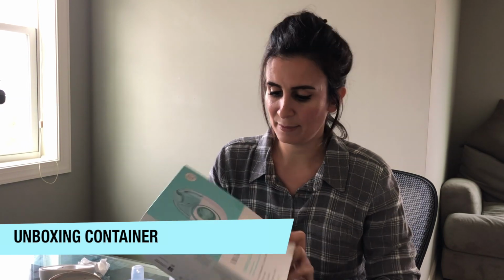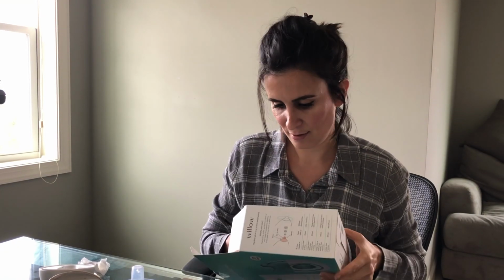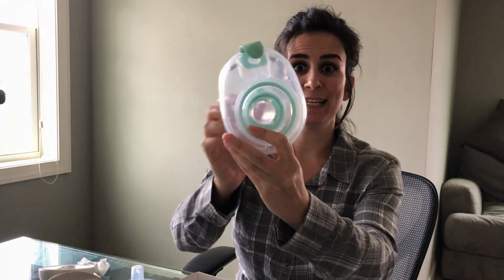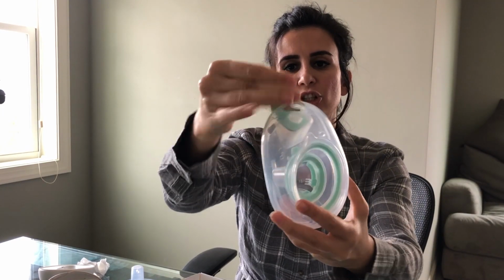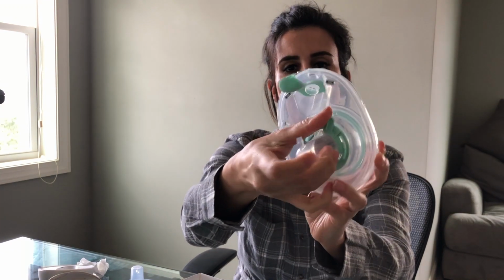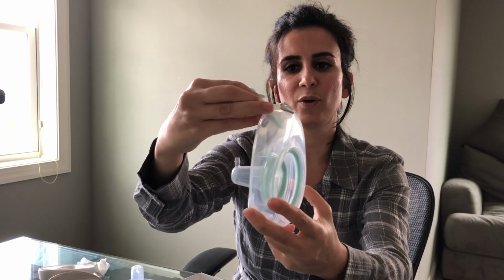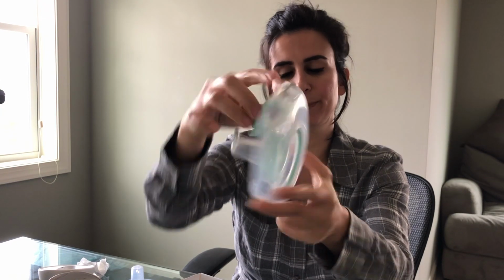Okay guys, the next thing I want to talk about is the sizing this container comes in. As you can see here, we have two containers at 27 millimeter flange sizes. Okay, so this is what's inside, and this is what the container looks like. I will describe what these pieces do, but you have a bunch of moving pieces here: lock, unlock dial, the actual insert, and we have a little air vent up here. They have a 1 and a 2 mode, and obviously this goes on top, but this is where you empty the milk.